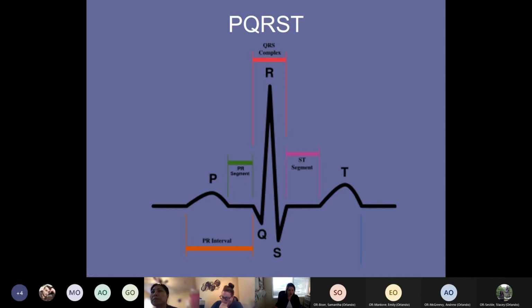That is systole. It's when the heart beats. Okay. This is super narrow because remember, that impulse is following that bundle of His and bundle branch highway, and it goes really fast on those highways. That's why it's narrow. And then we've got our ST segment. What if that ST segment is elevated? What does that mean? And the MI. Yes, right? ST elevation MI, okay? Injury has already occurred.